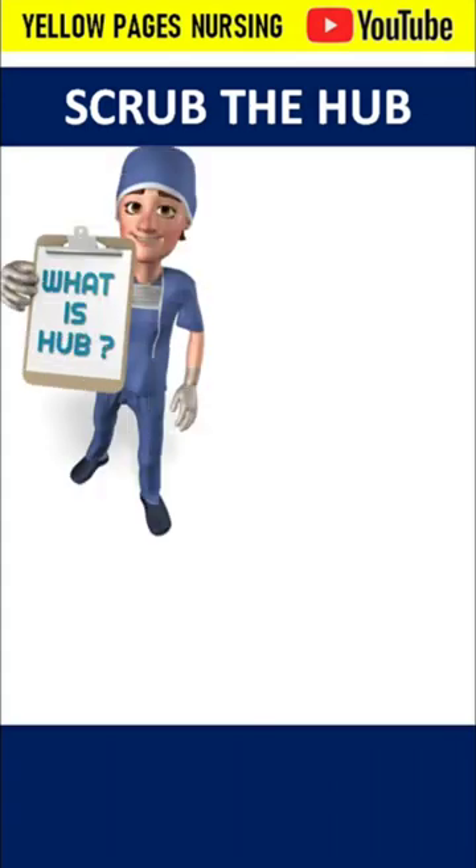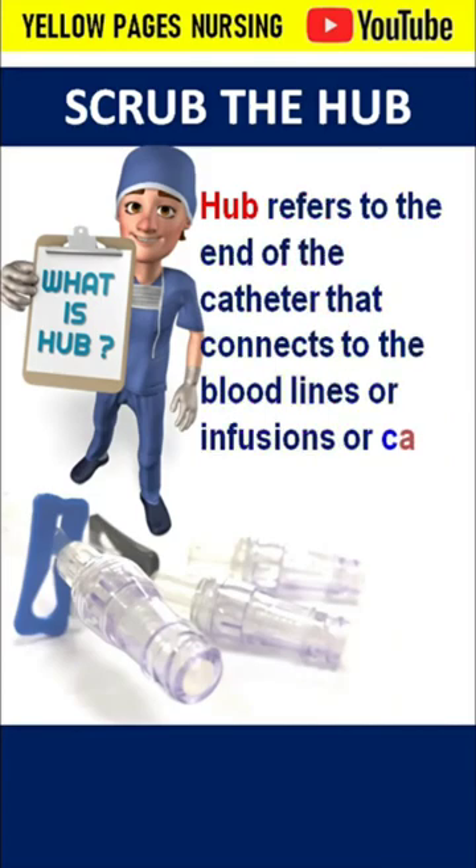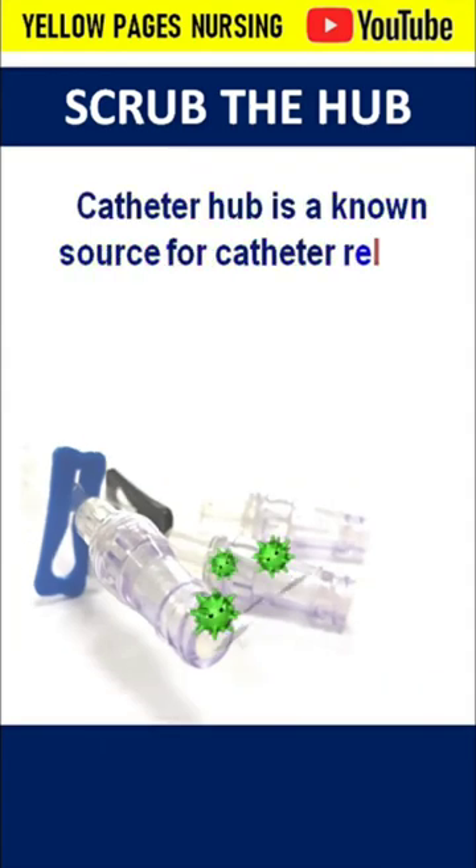Scrub the hub — what is a hub? The hub refers to the end of the catheter that connects to bloodlines, infusions, or caps. The catheter hub is a known source for catheter-related bloodstream infections, and needleless connectors are sources for microbial contamination.